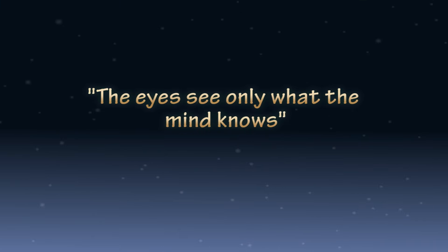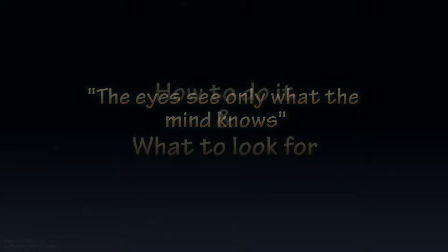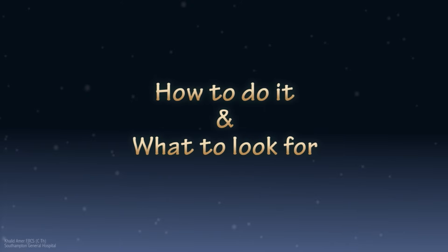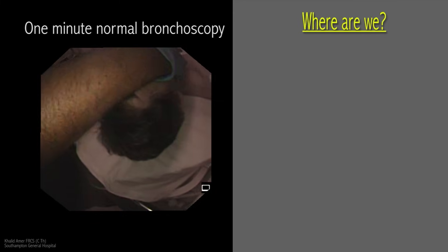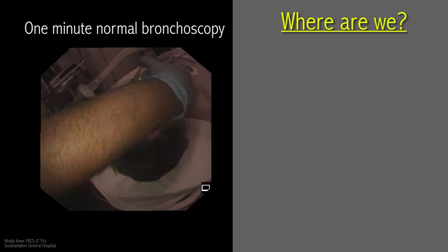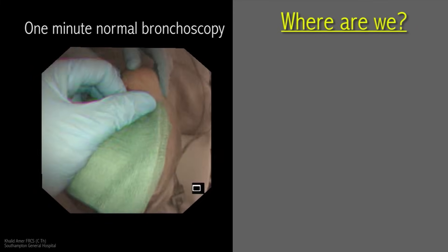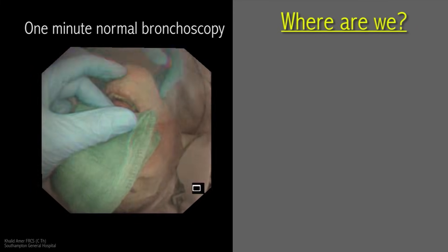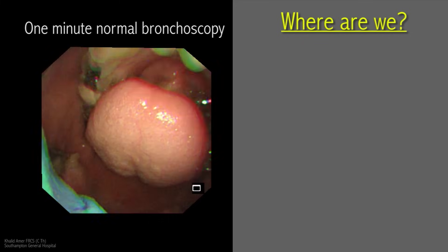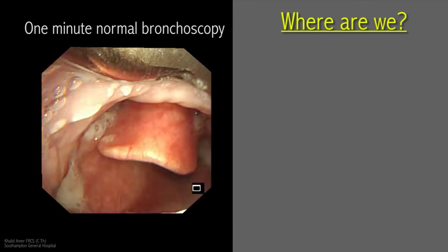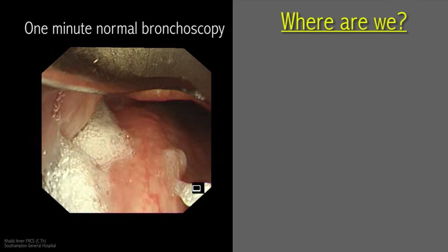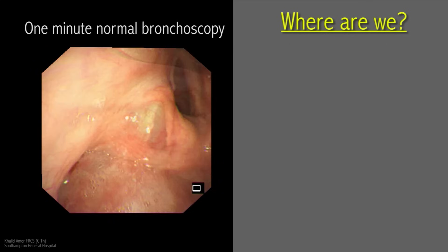There's an old dictum that the eyes will see only what the mind knows. This couldn't be more true than in bronchoscopy. To see the abnormal, the eyes have to be trained to identify the normal. At this stage I'm going to leave you with a one-minute normal bronchoscopy, and I would encourage you to try and name the bronchial divisions as we go along.